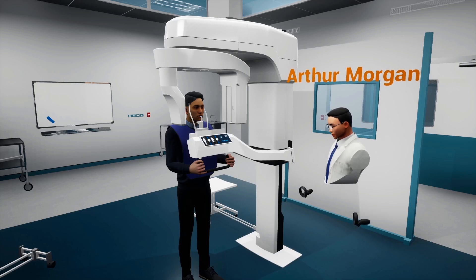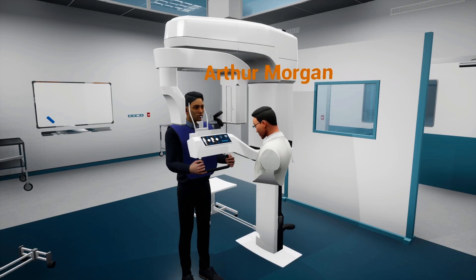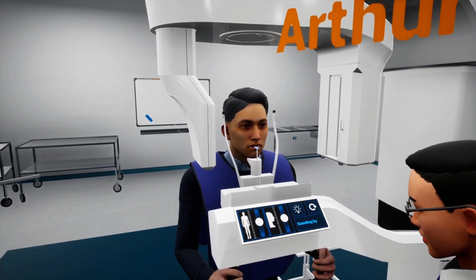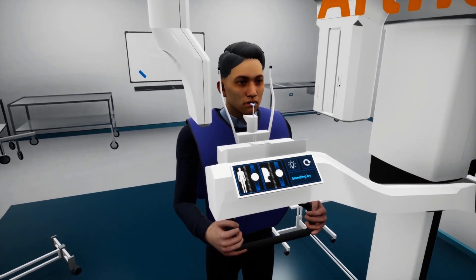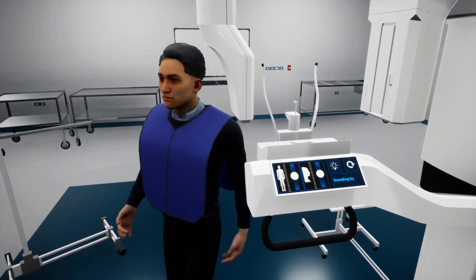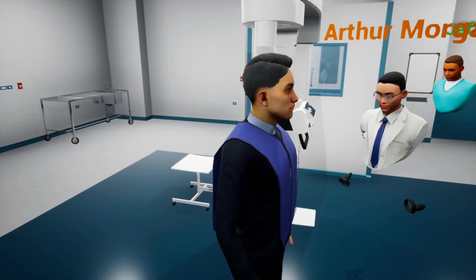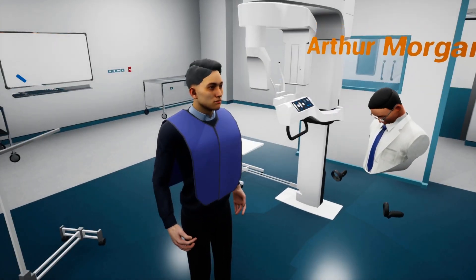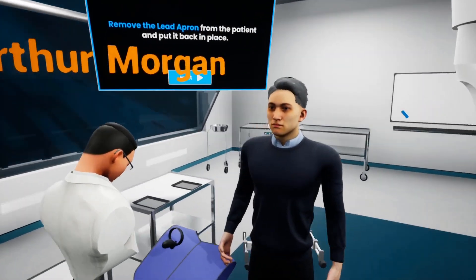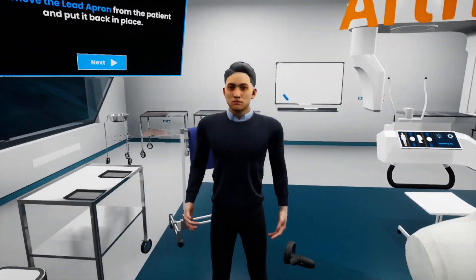Once the machine gets to a halt and the final beep sounds, the imaging process is concluded, and we can now release the forehead supports. Once the support is released, ask the patient to step away from the machine. Take the lead apron off the patient and put it back in its place, then head back to the machine and remove the used mouthpiece and dispose of it in a medical waste bin.